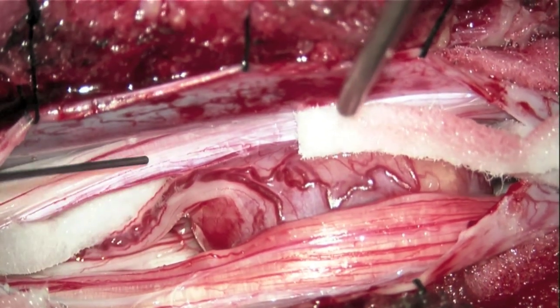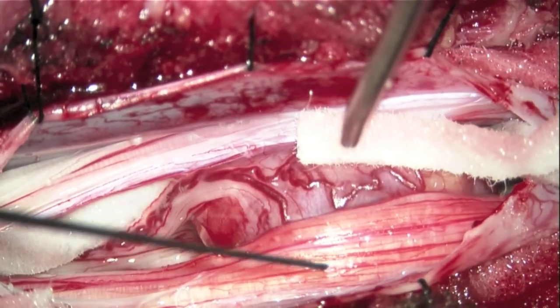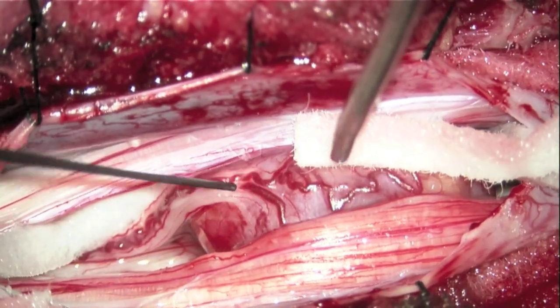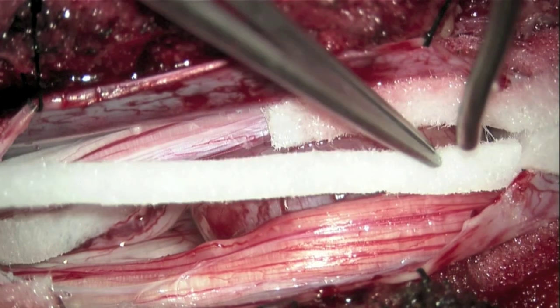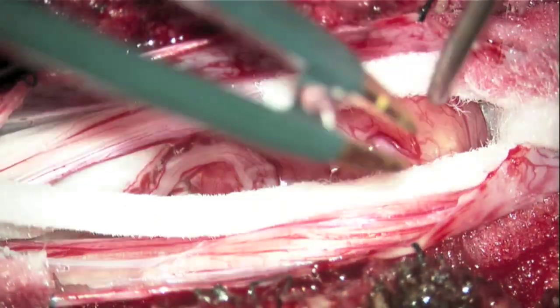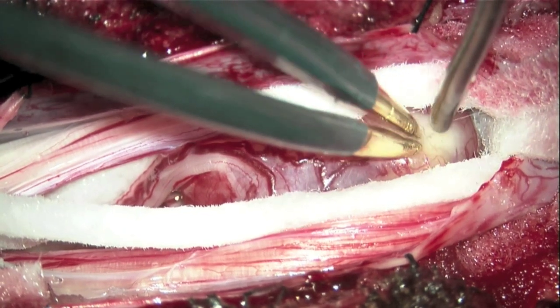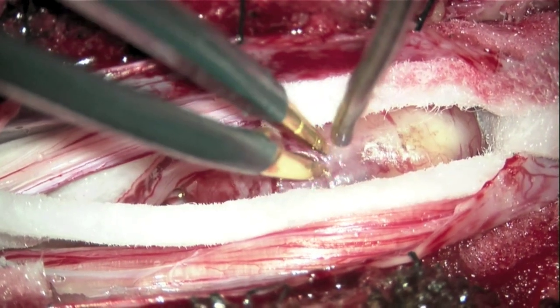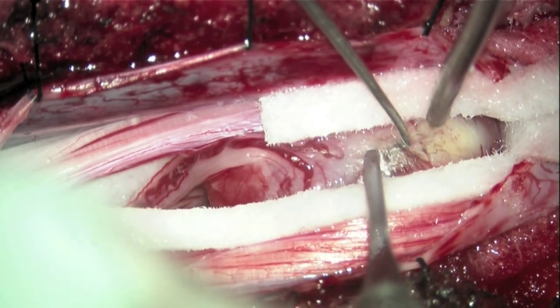A nerve stimulator is used to obtain control recordings. Nerve stimulation also confirms the non-functional nature of the tumor root of origin. The exposed cauda equina nerve roots are carefully protected, and the tumor capsule is cauterized in a safe and accessible area. The tough tumor capsule is sharply incised to allow for internal decompression.